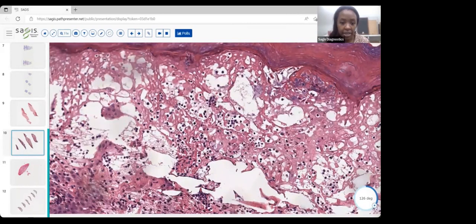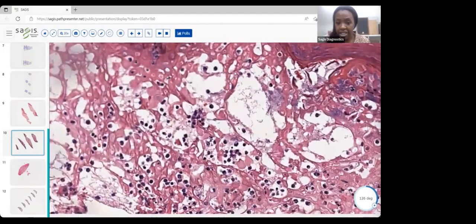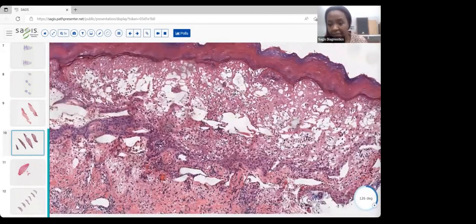We're seeing these keratinocytes that are enlarged, and there's quite a bit of breakdown here. It's kind of hard to find a good keratinocyte, but here we go. We're seeing these keratinocytes that are enlarged. Yeah, and I think that's actually just a very good point. Again, we have less success finding more intact cells in the center of this kind of vesicular area. We're going to have more luck at the edges. Just remember that, keep that in mind. So at the peripheries of the intact epidermis.